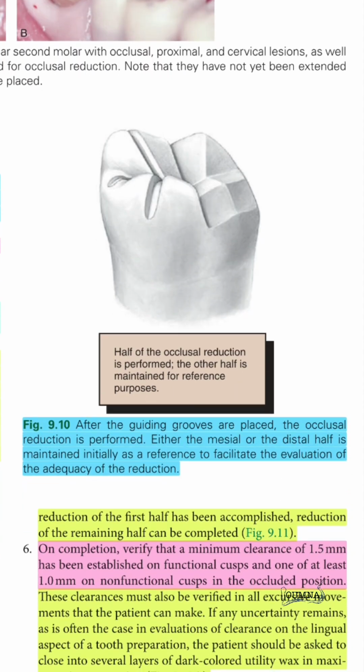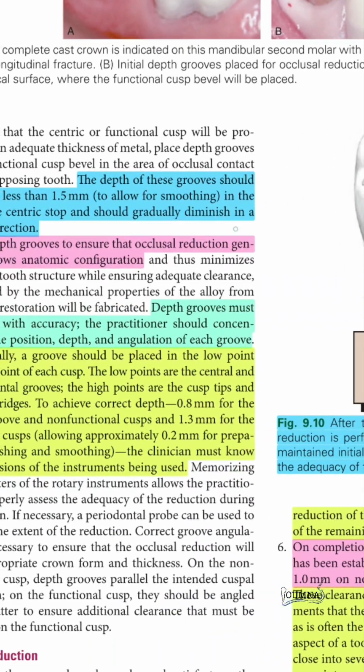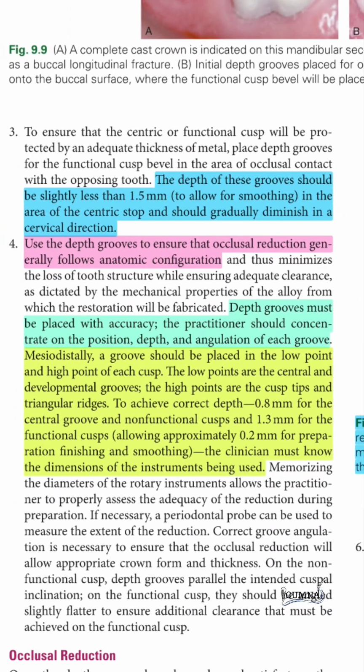As for maintaining the accuracy of the preparation, it is recommended to do a half preparation either in the mesial or in the distal to have a reference that will facilitate the evaluation of the adequacy of the reduction. It is recommended that we do not go for the whole depth from the first preparation, which is the 1.5, so that we allow more reduction or more space for the smoothing at the end.